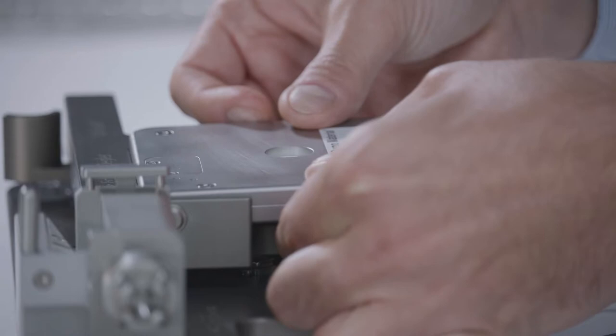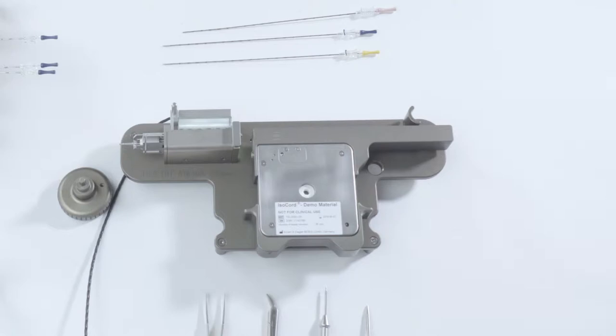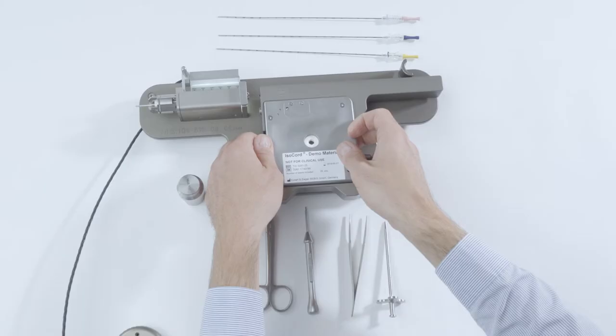Remove the magazine and check whether the C-chain was damaged when you were trying to move it. If the C-chain is intact, please reinsert the magazine. If the C-chain still does not move out of the magazine, you need to thread it in manually.